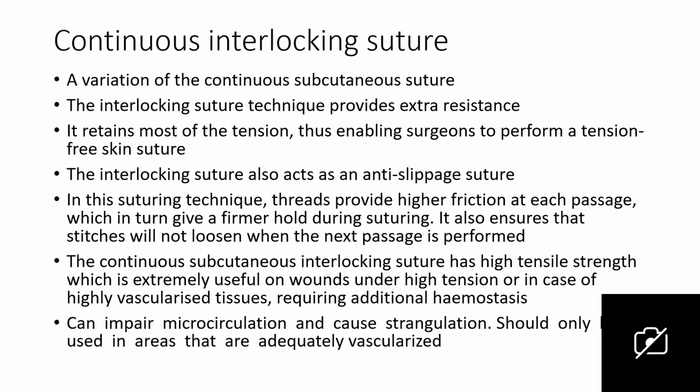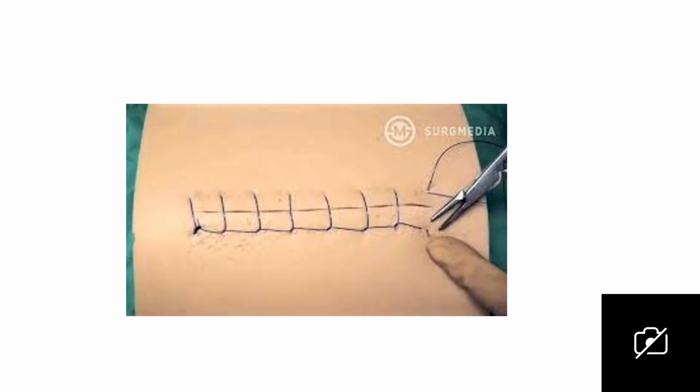This technique of sutures can impair microcirculation and cause strangulation with this interlocking. It should only be used in areas that are adequately vascularized. This is how it's done.